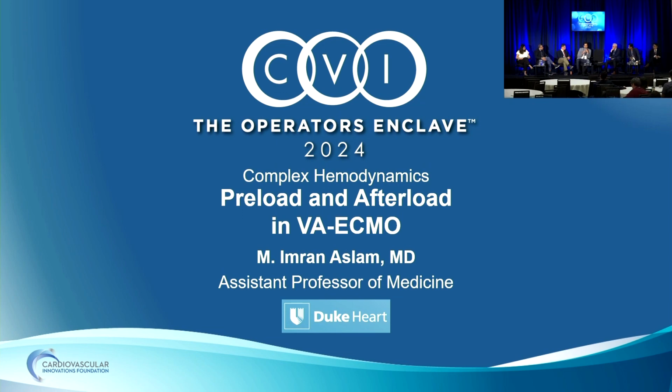And I think that illustrates the question about whether the pericardium is a target. Here we're not treating the pericardium directly, but we're getting rid of the interventricular dependence to a big degree by creating this big shunt. We use like 18, 20 millimeter balloons to basically create a non-pressure-restrictive ASD in these patients. And we really see a nice equalization and then rapid decrease in biventricular filling pressures without the expense of another MCS device like in this patient.